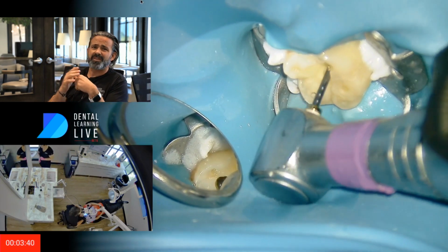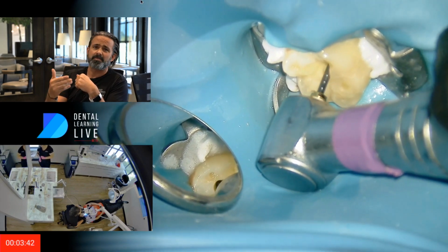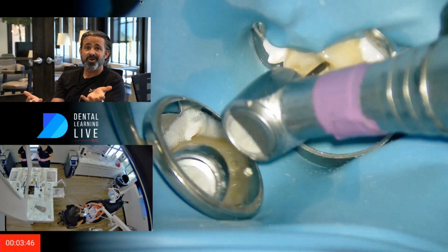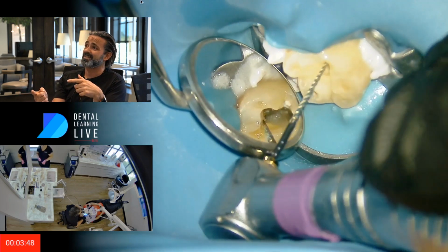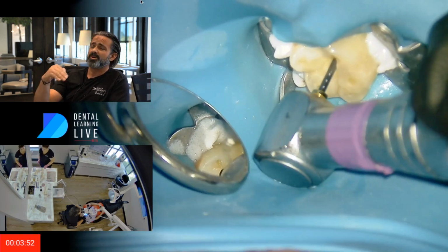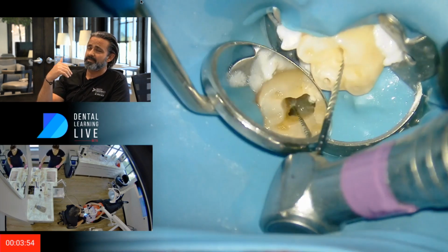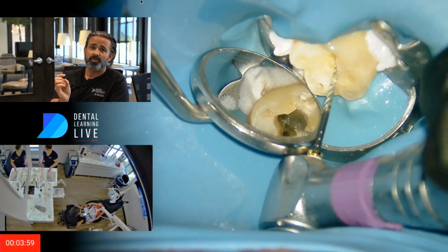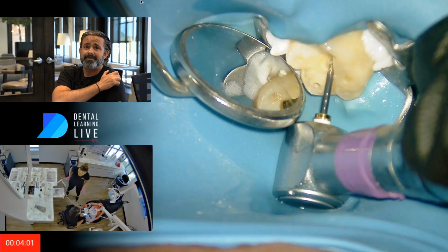I was leaning up against that composite because I wanted to know if it was a pulp cap, and I wanted to know if I'm going to use GentleWave on this case, if it's going to wash out. And what I was doing with that burr, in the perspective of the microscope, was visually looking to see if that's carious or if it's some sort of pulp cap material or something going on in there.